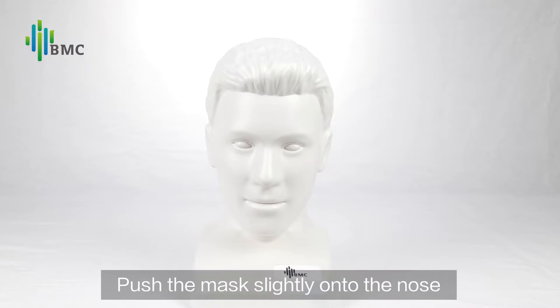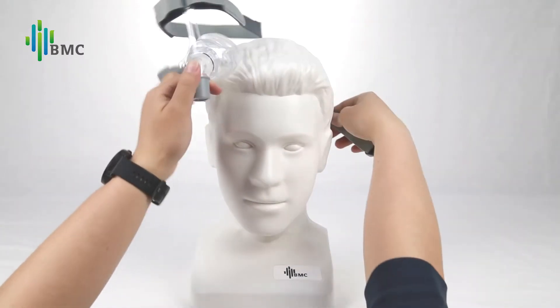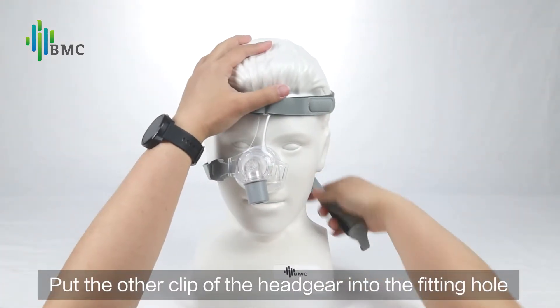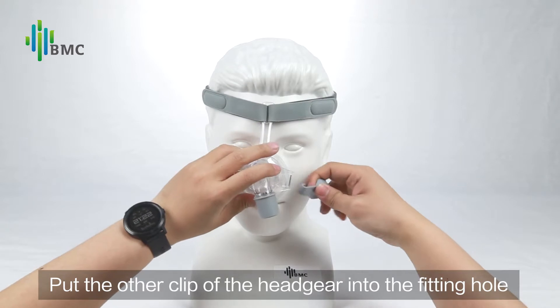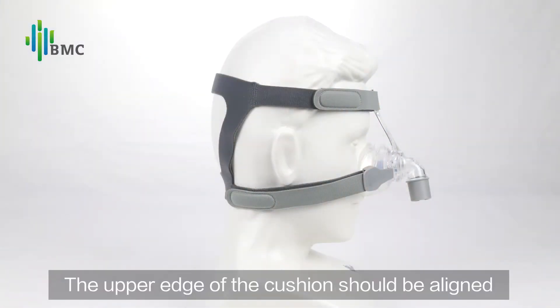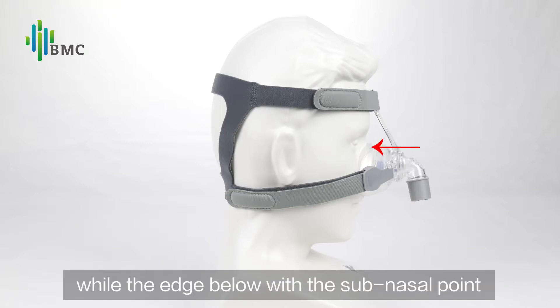Mask Fitting: Push the mask slightly onto the nose. Pull the headgear over the head top. Put the other clip of the headgear into the fitting hole. The upper edge of the cushion should be aligned with the nose root, while the edge below with the sub-nasal point.